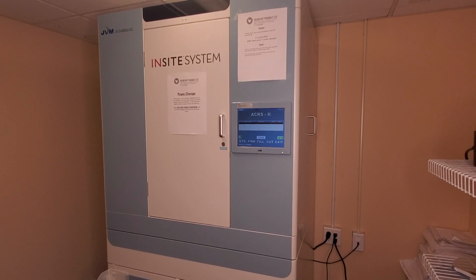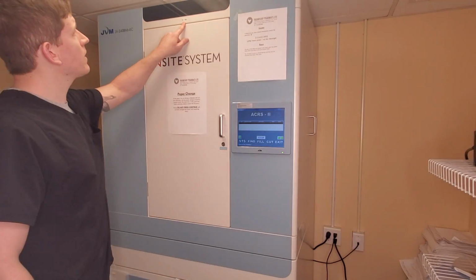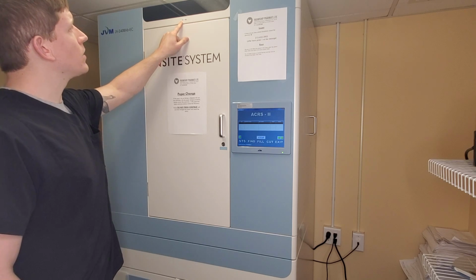Now, there are 3 cabinets in the Insite machine. There is the main large cabinet in the front, there is one on the left, and one on the right. We at the pharmacy have labeled each of the cabinets by their range of numbers, and we've put that right above each cabinet in the middle, as you will see me demonstrate in a second. This is to help you easily locate the canisters. So that's where the numbers of the canisters are.